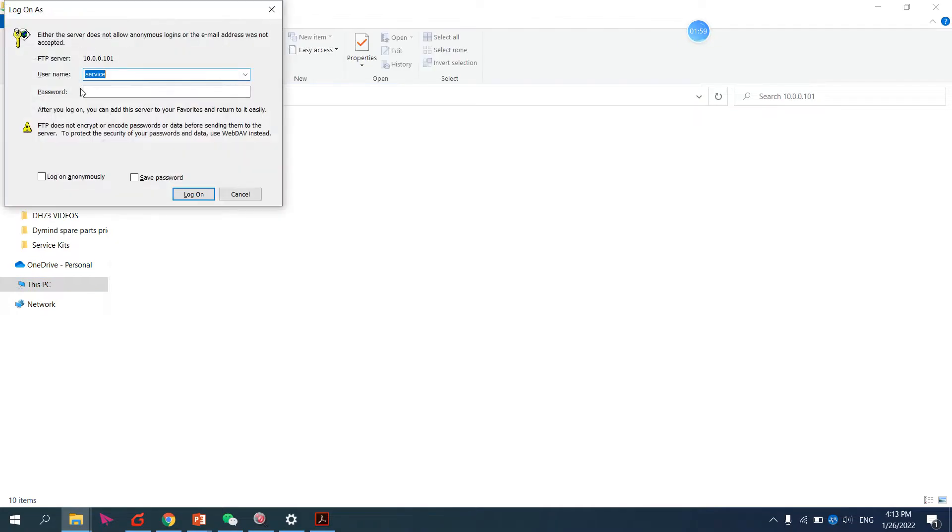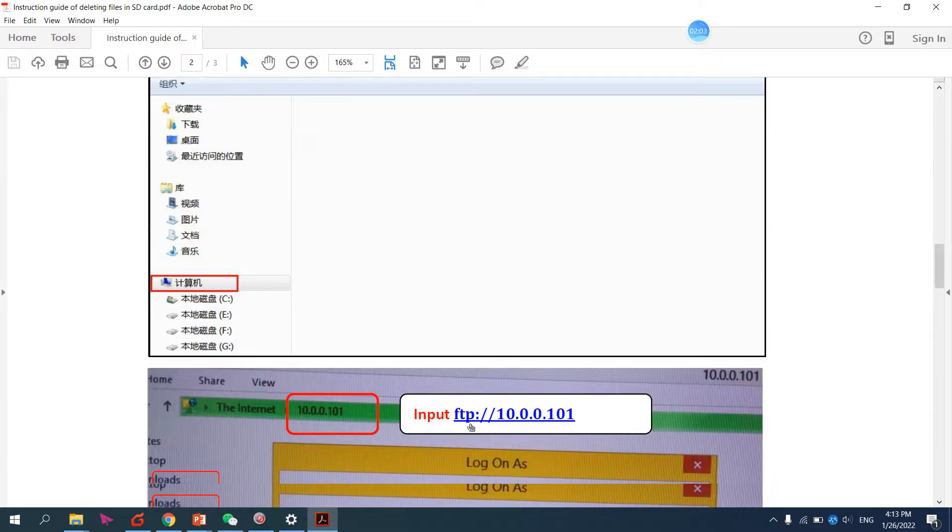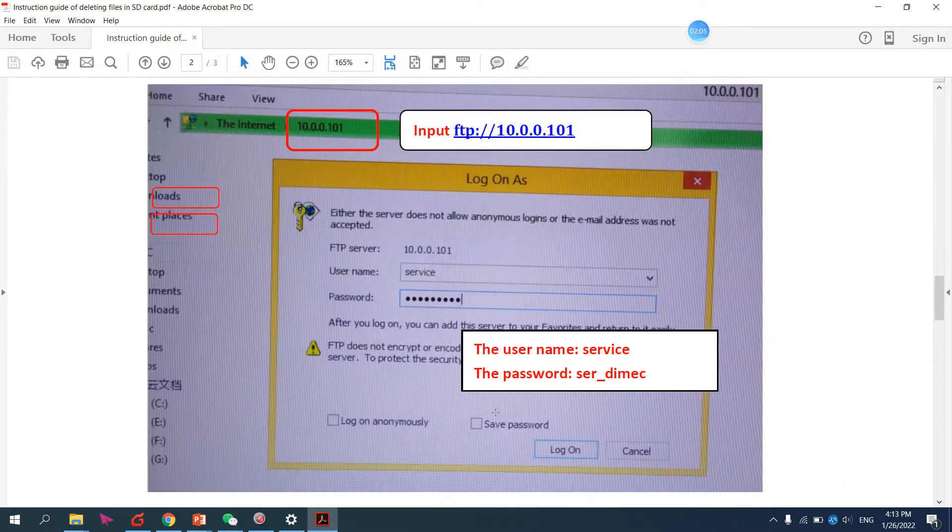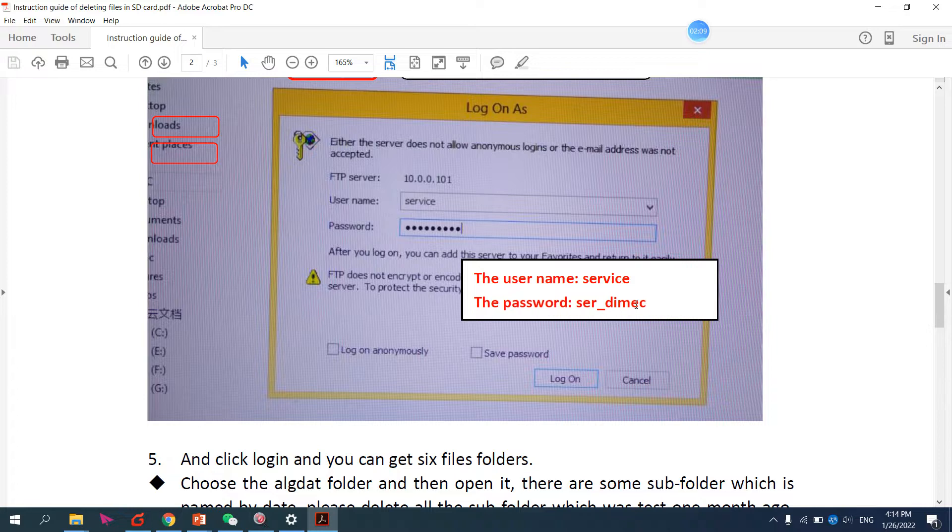The username is 'service' and the password is 'ser_dimec', as already given here.